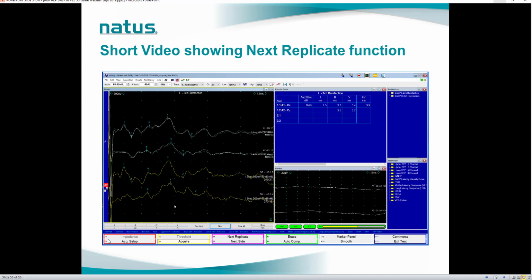Then we'll continue to average for at least 1500 times, and you can see the number of averages next to the average sweep is about 19 now. So you have 19 rejected sweeps compared to what you are averaging right now. You average it for about 1500 times. From here you will also see that the waveforms have already been established.